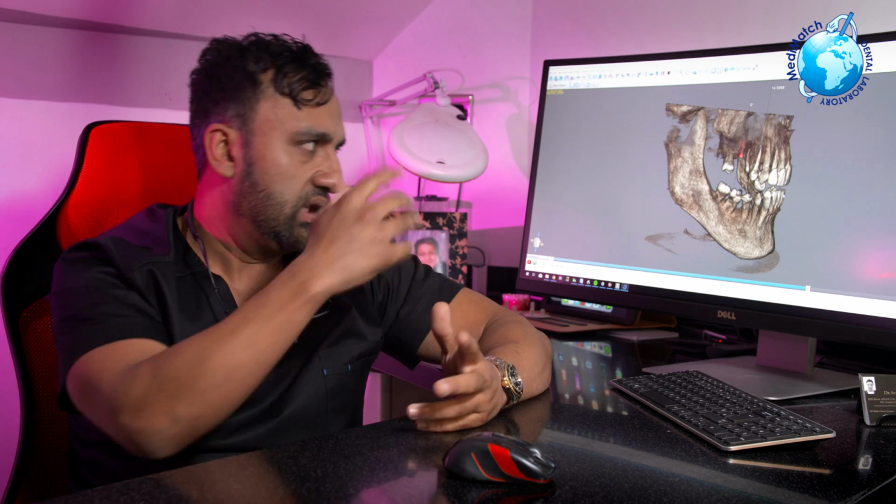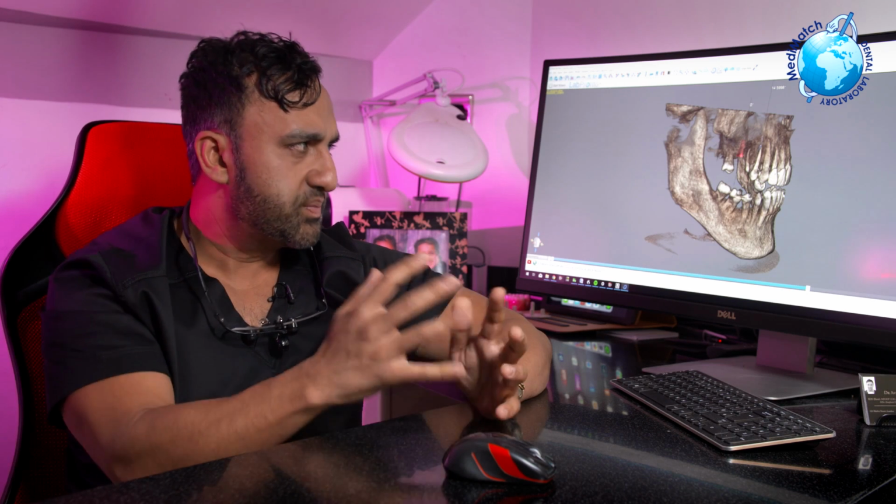And as you all know, in the posterior maxilla, the bone quality is generally quite poor. With this particular patient, he presented with a few chronic periapical areas around the teeth and chronic infections. We were able to very gently remove the teeth, preserve the alveolar bone that we needed, as well as remove and enucleate the cysts that were present and place some implants around there.